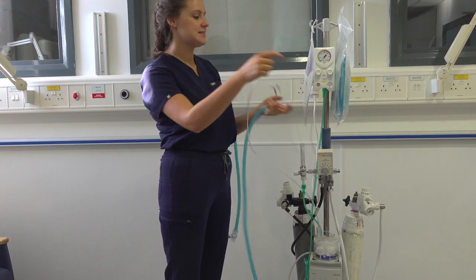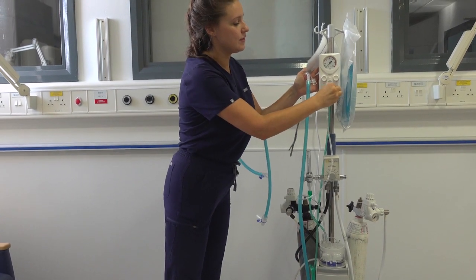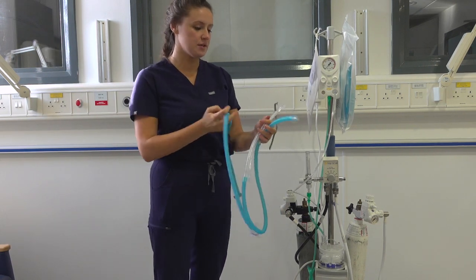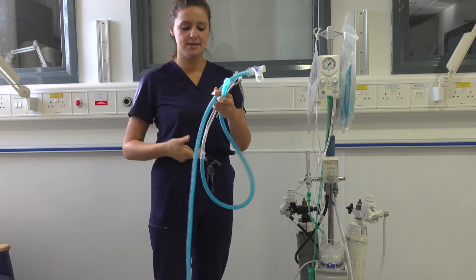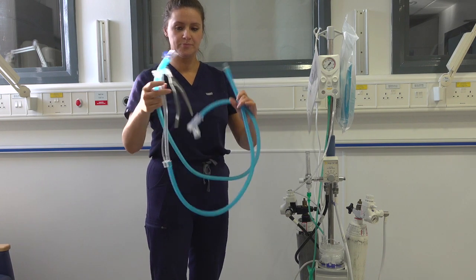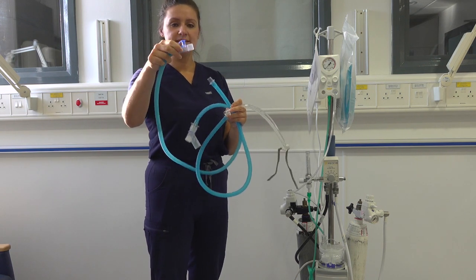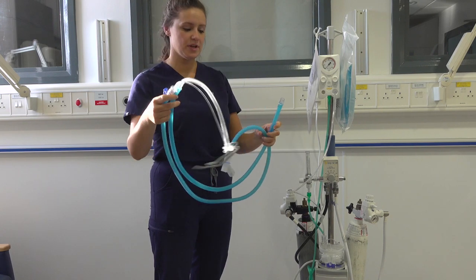The other end will connect into the RPOP. Now that we've got that done, we can then hook the humidification circuit into the RPOP circuit. And to do that, we simply insert this end onto the clear end of the RPOP circuit.